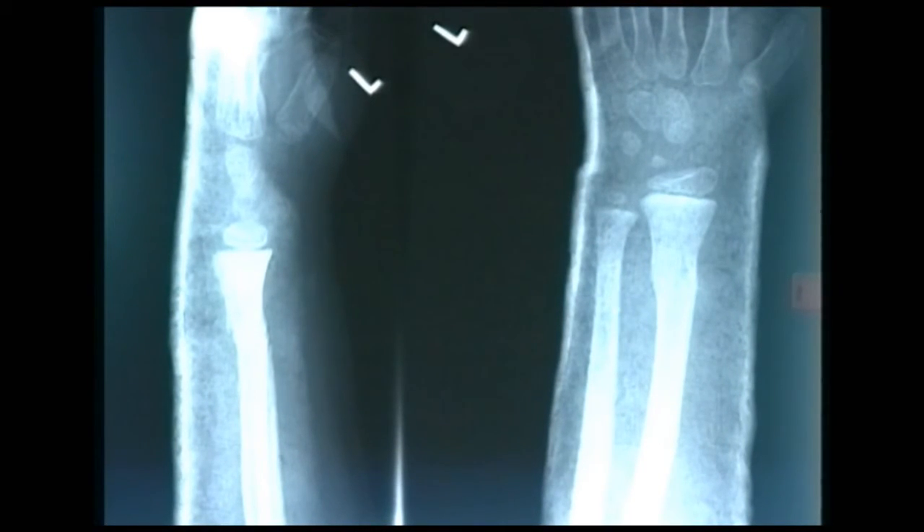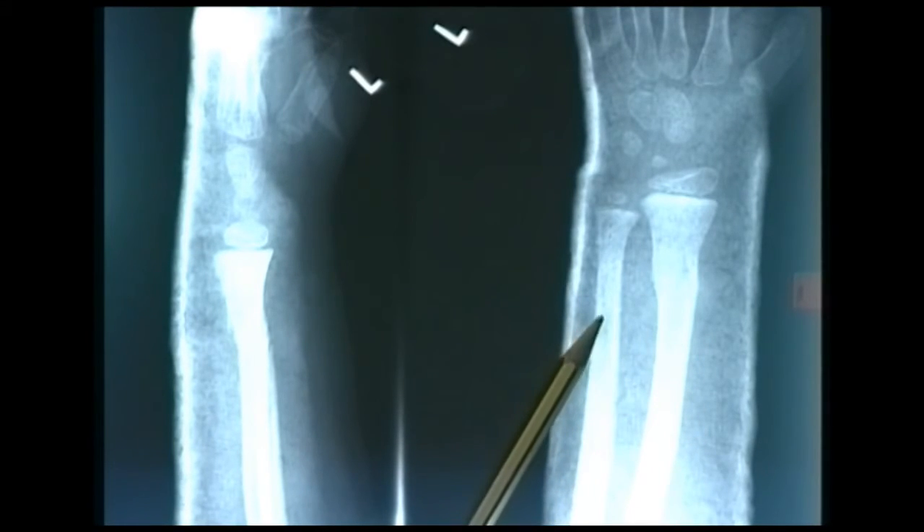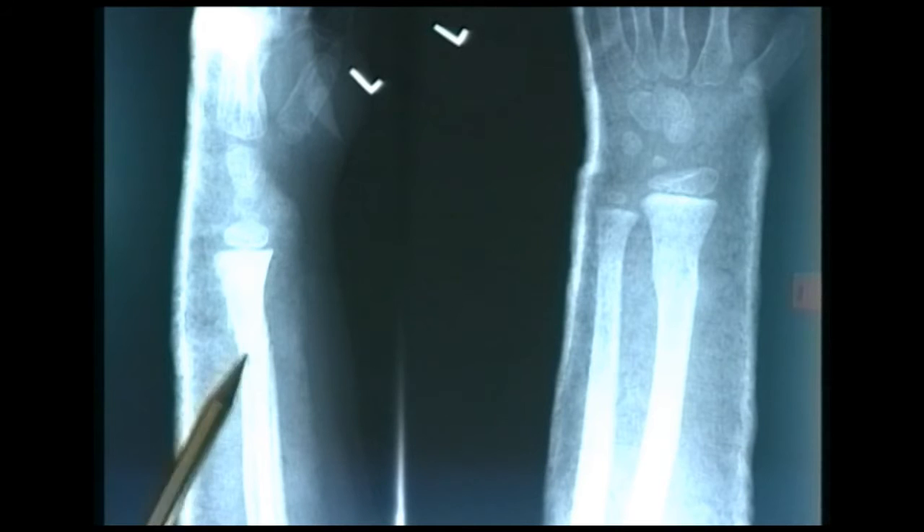This is an AP and a lateral radiograph of the distal forearm and wrist from a child. We can see that the patient's in a back slab, with plaster shadowing at the dorsum but not present on the volar surface. The injury present is a fracture of the distal radius and ulna, seen on the AP radiograph and in the lateral view.